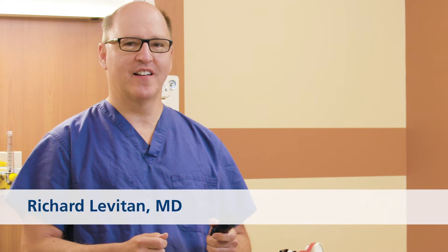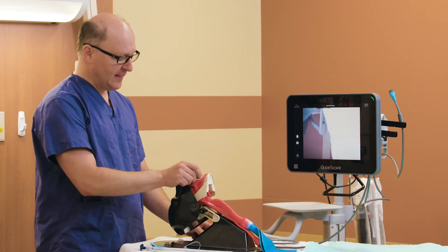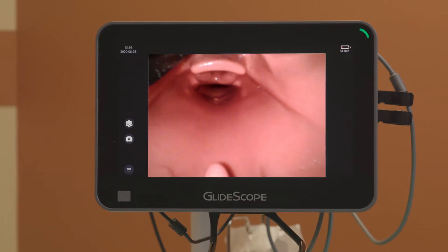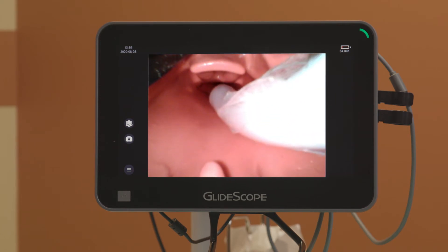Hi, my name is Rich Levitan and I'm going to share with you my insights into video laryngoscopy, but you should always refer to your operations and maintenance manuals for your GlideScope products. When using a hyperangulated blade with a rigid stylet, on occasion there may be an adequate view, but there may be mechanical problems trying to advance a rigid stylet into proper positioning.